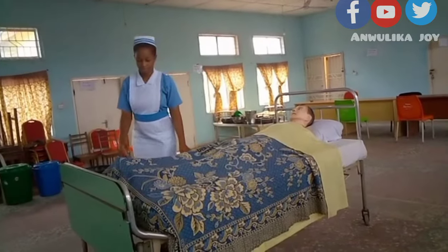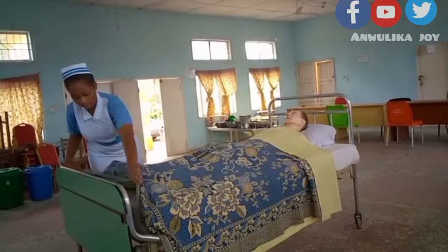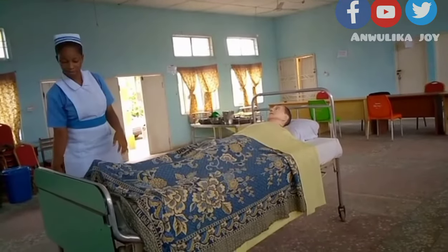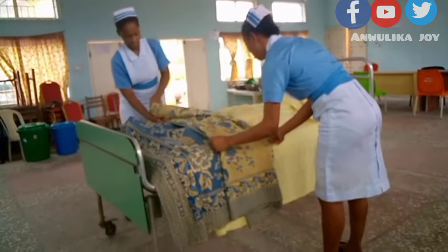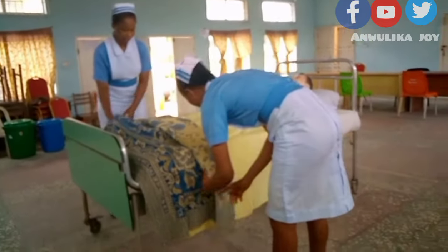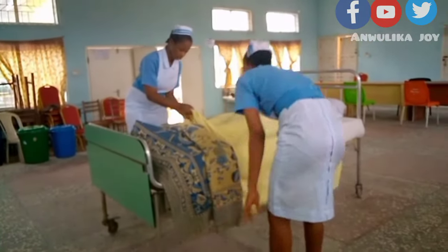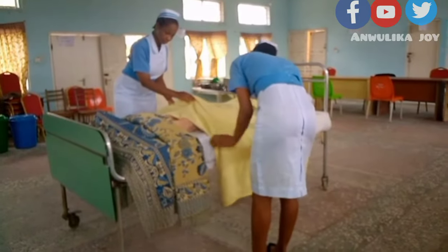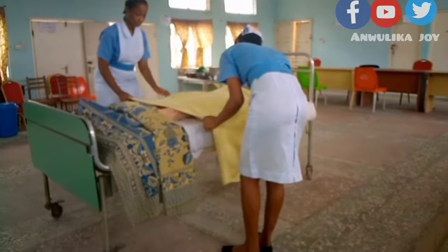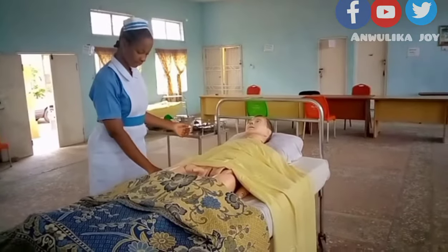We will arrange bed clothes as far as the bottom of the bed, leave the patient covered, and just expose the area needed for catheterization, which is the pelvic area. We will place the patient in a dorsal position with knees flexed — this applies to a female patient. We also need to wash our hands.